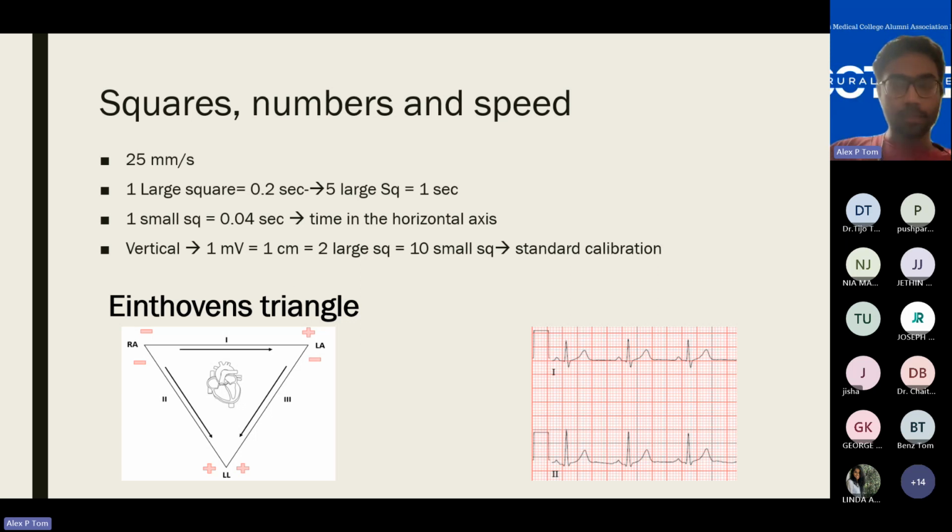And from that setting, we have the boxes and the distance and so on in the paper. From this, we can calculate and come to many conclusions. That will essentially tell us what the time is on that paper. So how do you say that?